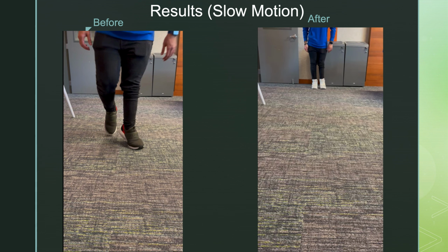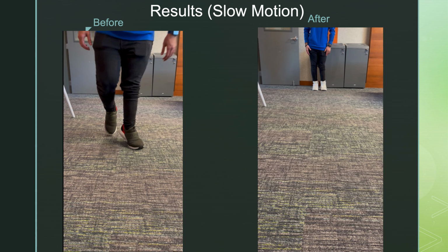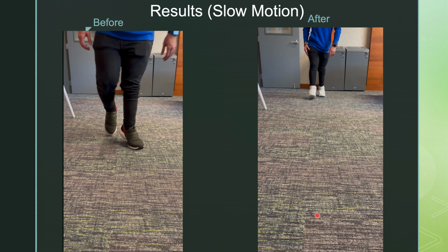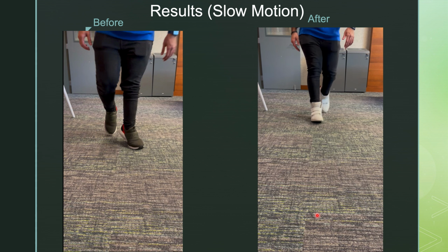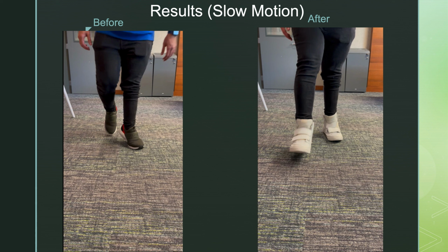And here is the normal walk with the design that we made. It's taking a minute to walk, but he's not leaning anymore. He's looking more normal. He's walking with fewer problems than before, less disturbance. But the customer had some suggestions that he wants us to consider to improve the design, and Ashley can tell us more about the improvements that can be applied to the design.